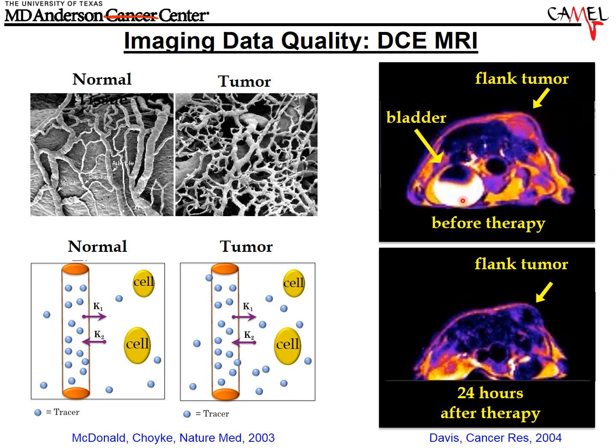The bladder also gets bright. I like to point out that I've been with many graduate students who have seen this image for the first time with their experimental agent. They get very excited to see the bladder light up, and then I need to remind them that that means 98% of their efforts have gone to the bladder and not to the flank tumor, but that's how physiology works.